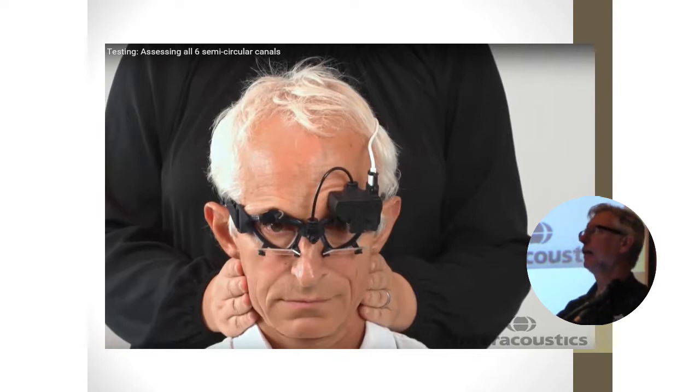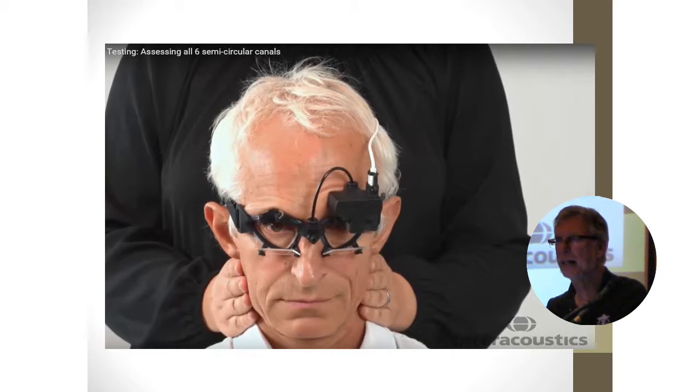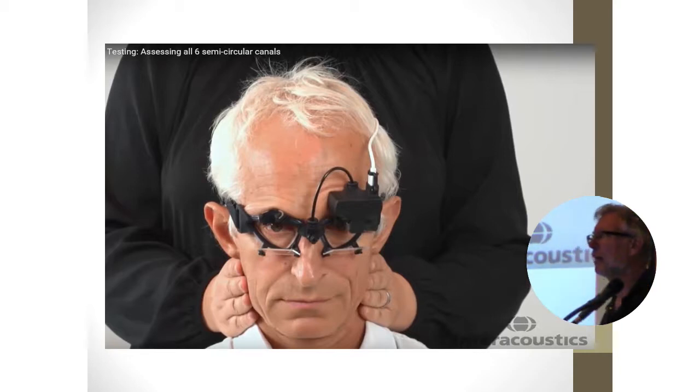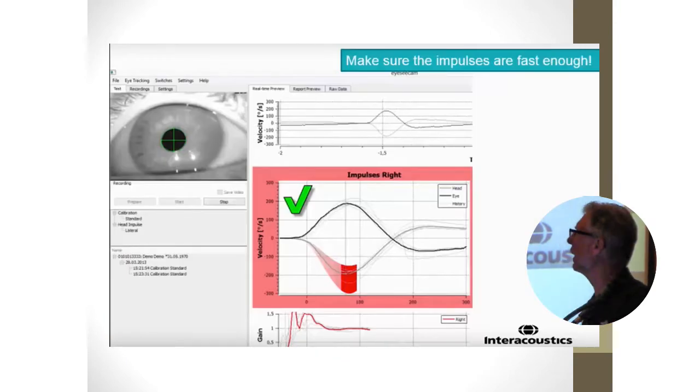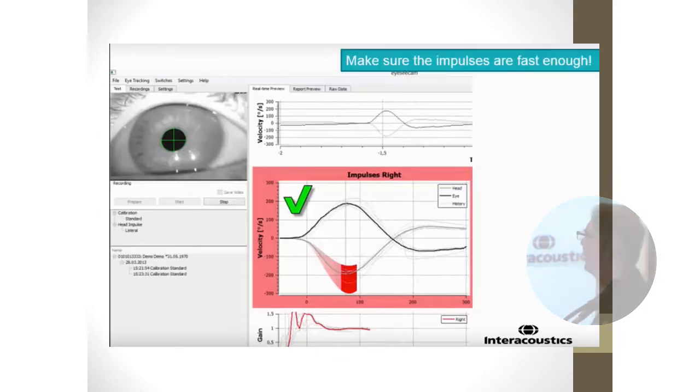Dr. Gans does a great job at teaching people how to do this. But the equipment actually teaches you how to do it as well. Because for every impulse that you try to make, when you do it correctly, you get a nice green check mark like this.